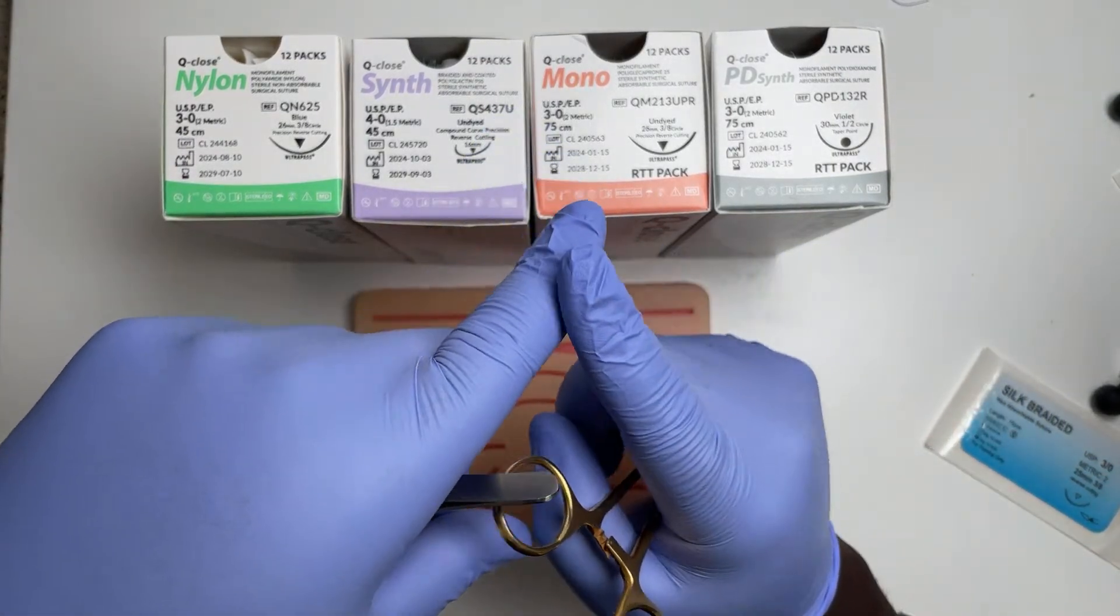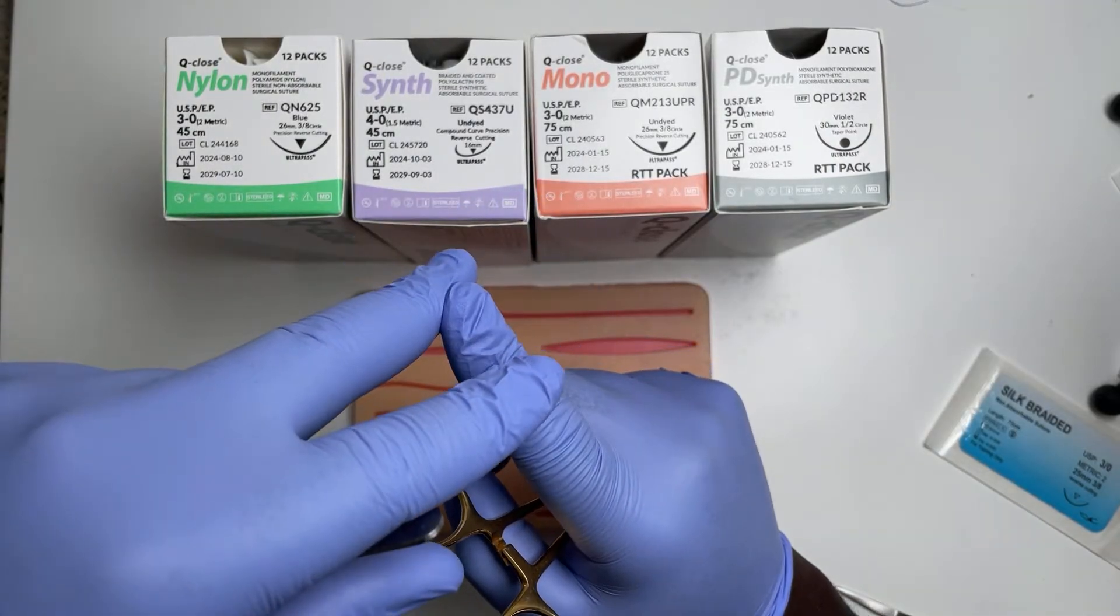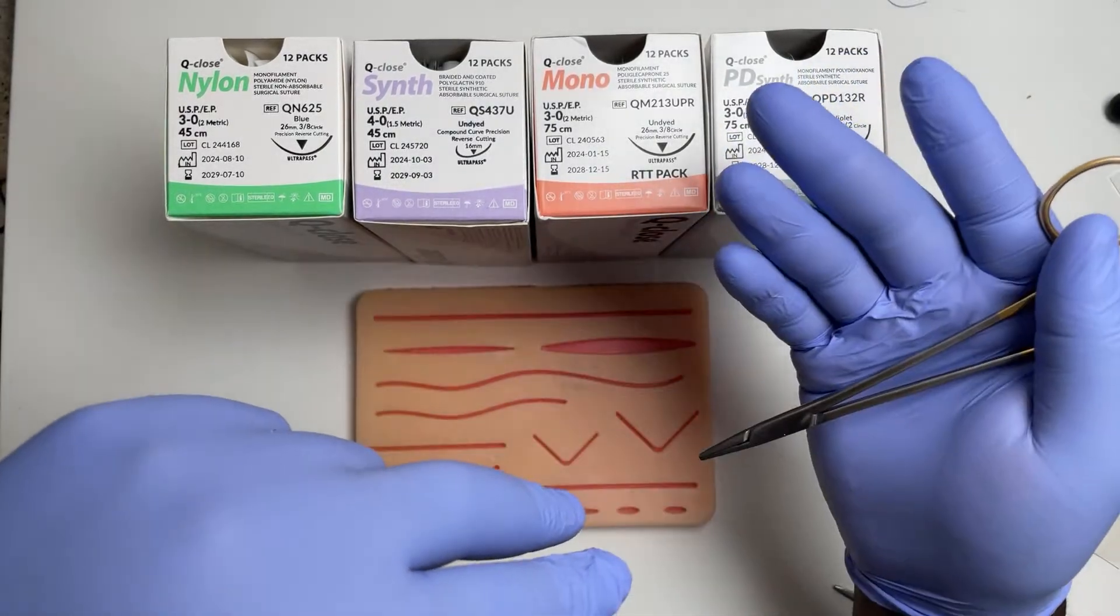So principles: dissolvable sutures in children because they don't like having stitches removed. Monofilament where you think there's a higher risk of infection, so you've debrided a wound.